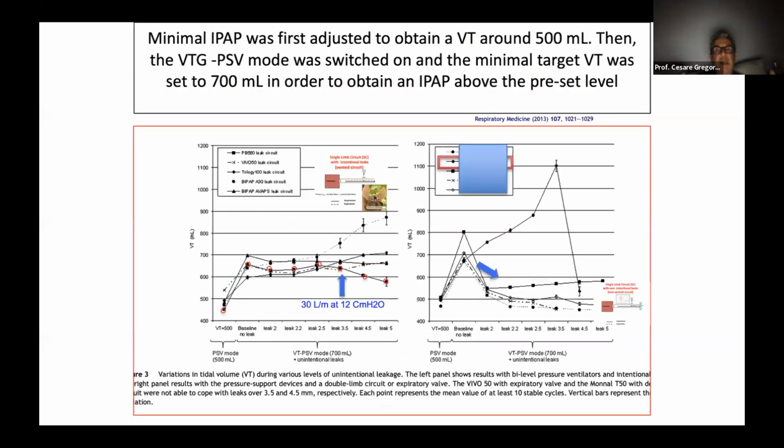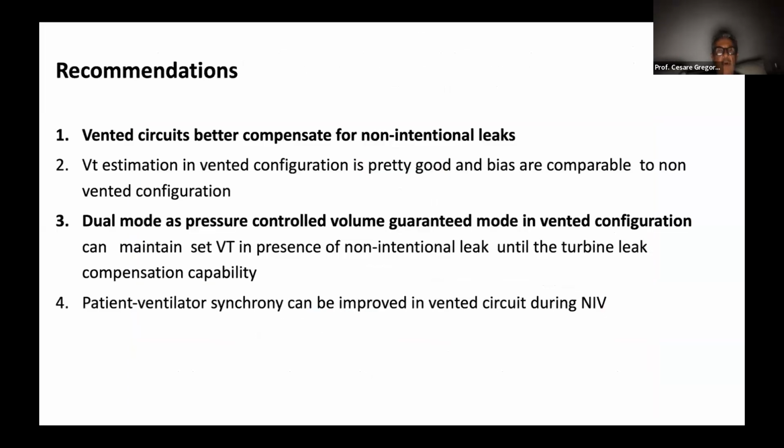And this was clearly demonstrated by Brigitte Farou, who found, I covered this because I don't want to say which kind of ventilator it was, that measuring the expiratory VT, we have a bigger overshooting, from 600 milliliters to 1000 milliliters. So measurement of expiratory VT is no longer used in dual mode.